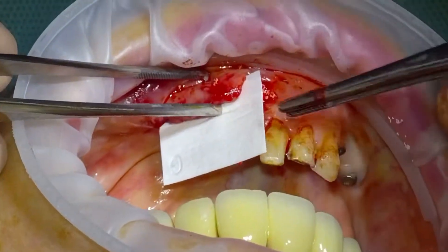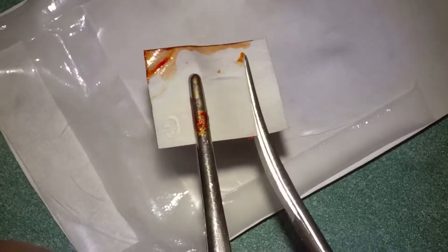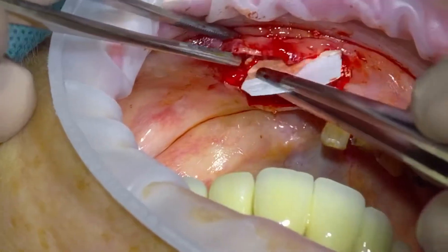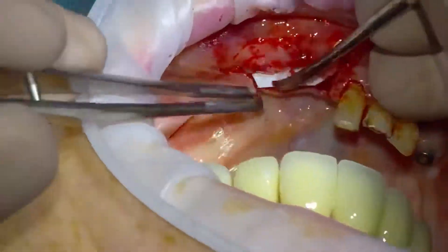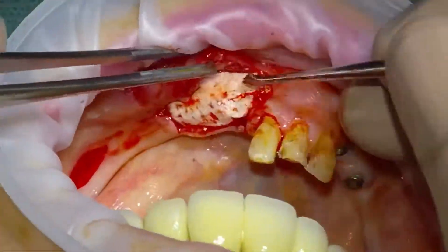This is the Jason membrane, which is porcine pericardium. We can just try it in for size and then trim it as necessary. It remains quite rigid — it's really lovely to handle. I've speeded up the video again because it's a very slow process, and I always like to tuck it in under the lingual flap too.